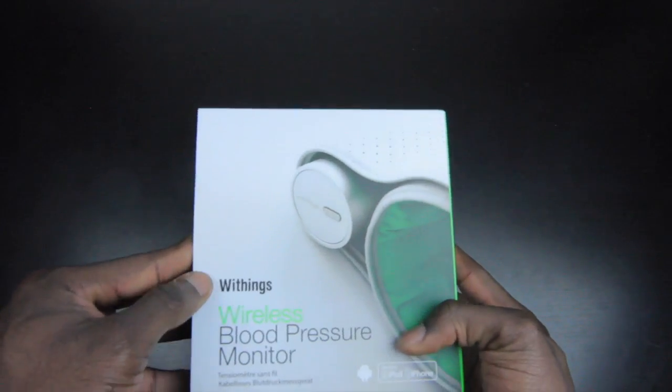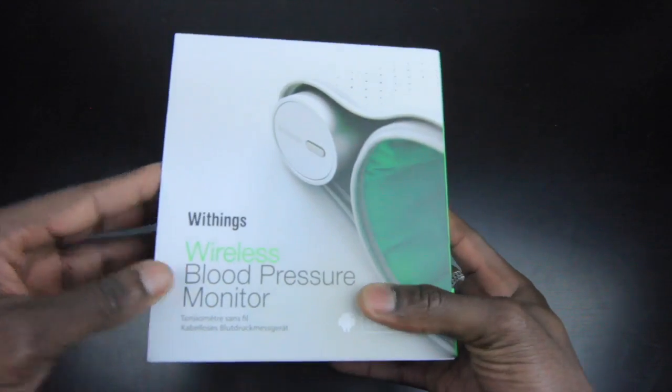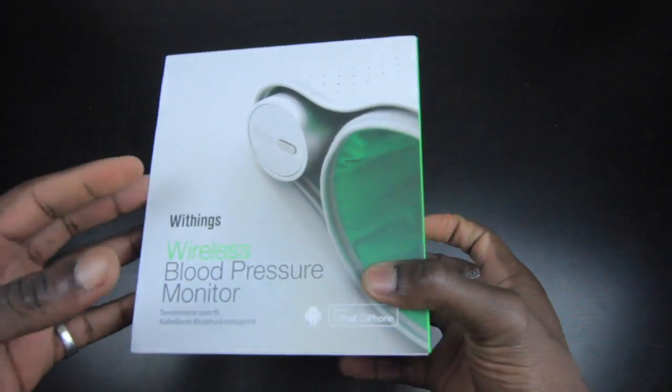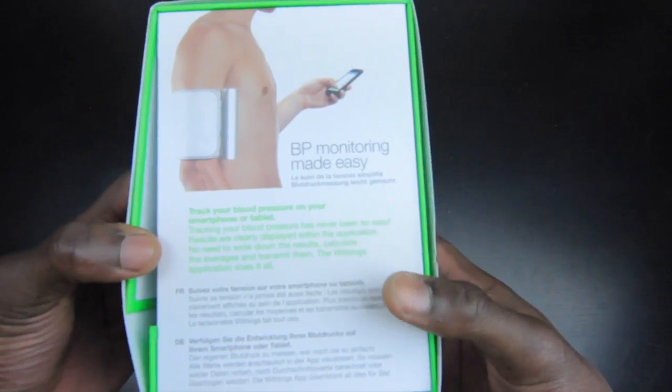Hey everyone, it's Gadgets Boy, and this is the Withings wireless blood pressure monitor. This is a smart device that connects wirelessly to your smartphone so you can measure your blood pressure.